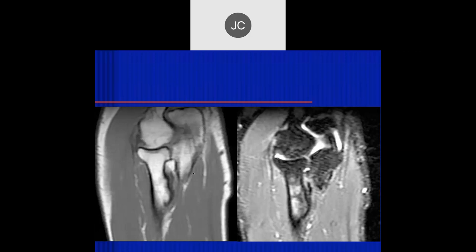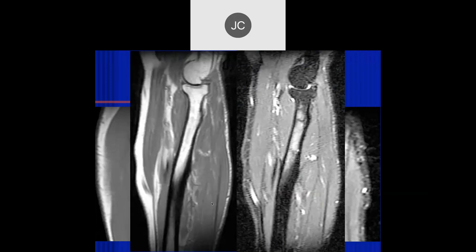Looking at the radius, there appears to be some increased signal proximally. On the T1 it looks pretty normal. Looking at the sagittal images, there's still increased signal there - but it's not in an area where I would expect failure of fat saturation, so I think the increased signal is real.